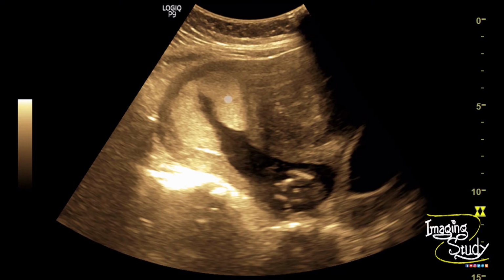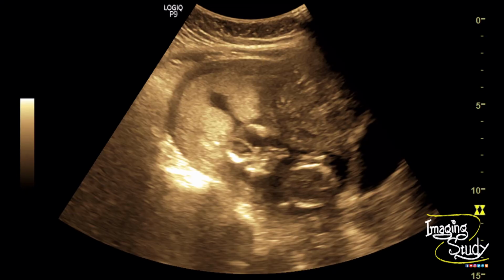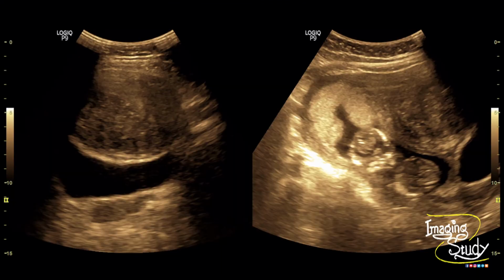Here's the picture of the placenta also getting compressed by the fibroid. Again, the fibroid causing compression over the placenta and the fetus. Again, the picture of the fibroid with its compressing activity.